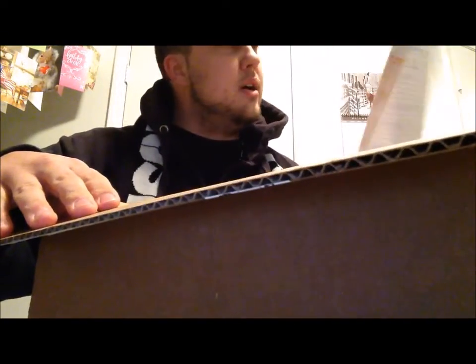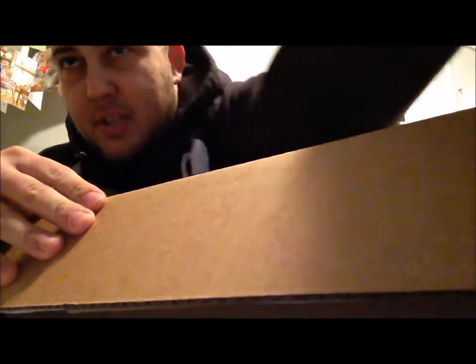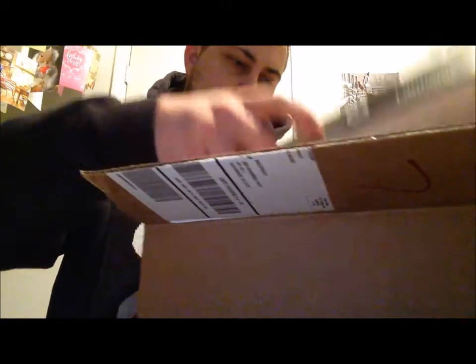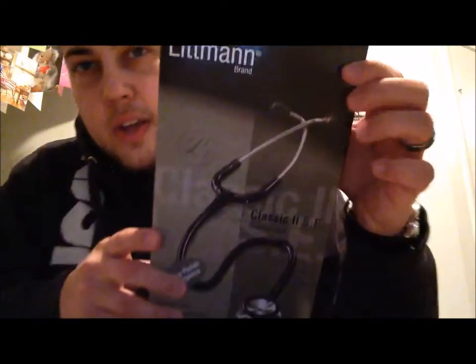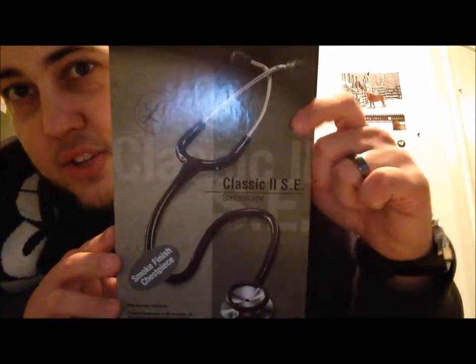Okay, it comes with a receipt from allheart. By the time you all see this video it's probably gonna be a little too late, but they're holding a special sale on all of their stuff. So here is this Littmann brand Classic II.